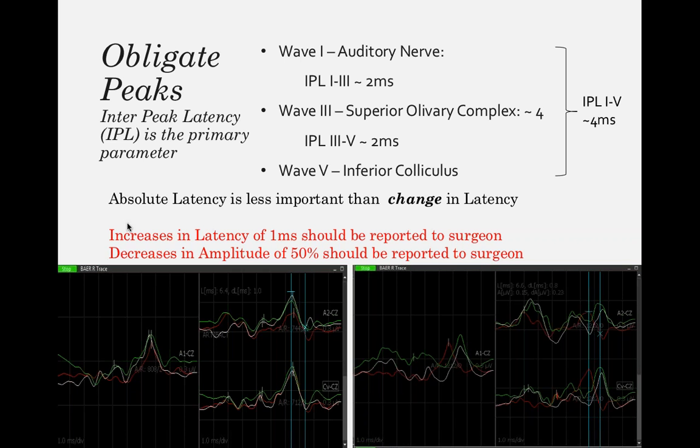And when we're thinking about what our alarm criteria is, any changes in latency, any increases specifically in latency of 1 millisecond need to be reported to the surgeon. And decreases in amplitude of 50% should be reported to the surgeon as well.